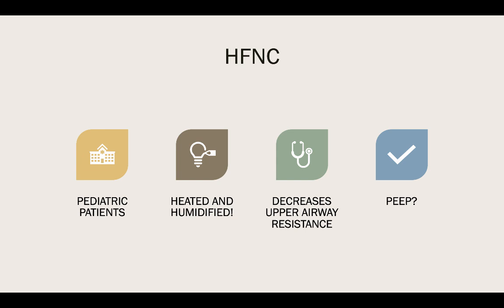And there is a debate whether or not this is PEEP, whether it's not PEEP. It kind of depends on who you talk to. So the general consensus surrounding this is it's kind of like PEEP, but it's not really PEEP. But high flow nasal cannulas can do a lot of good with patients with upper airway resistance issues.